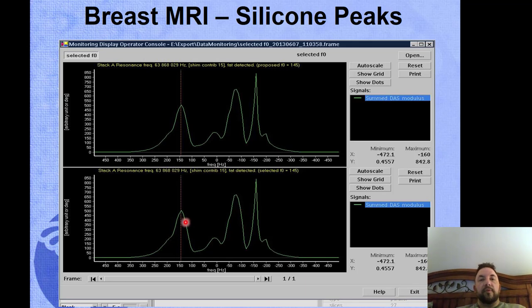So you go to perform the function of active shimming. We place the good volume shim. We're including as little air as possible. All of these tips and tricks of the good MR tech. And what happens? The system's showing you 1, 2, 3 peaks. So what I want you to kind of know and understand about it, and again, on Philips magnets, water is always left. On Siemens, it would be on the right.